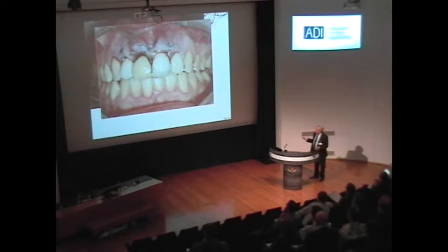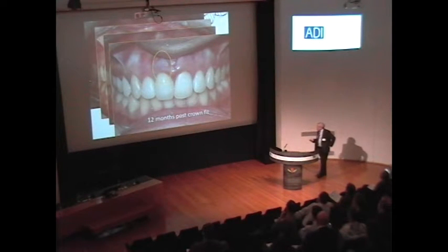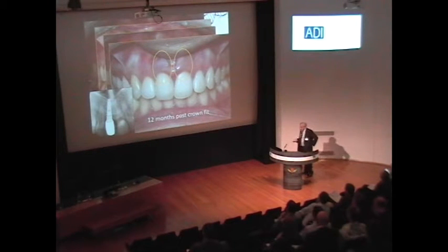That's what we get at the end of our surgery. That's what we get when we are going to expose the implant, and 12 months post-crown fit, that's what we have. Magnificent with the keratinized gingiva. Absolute mirror image of the other side, and that is our radiograph at this stage, showing how mature our crestal ridges are.